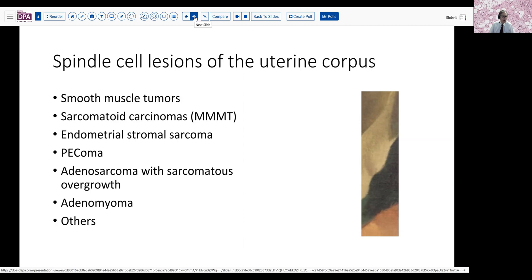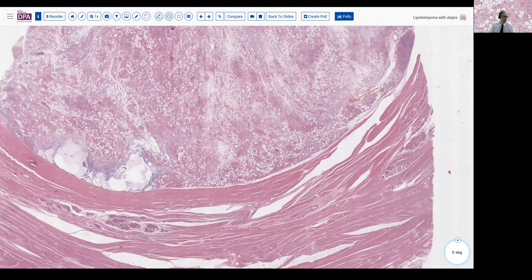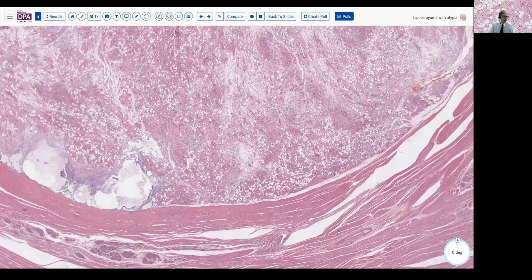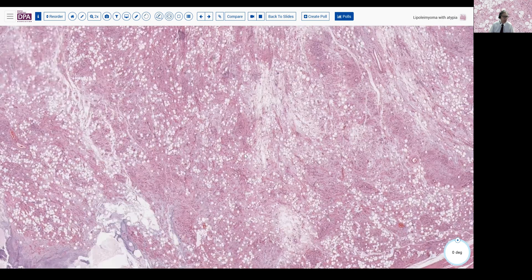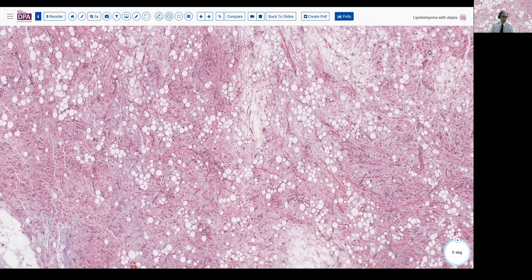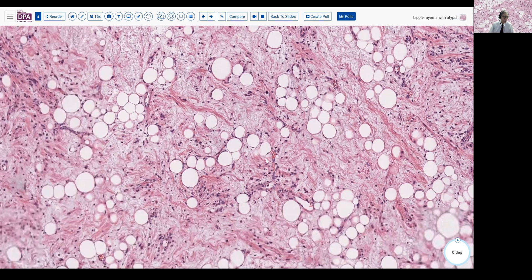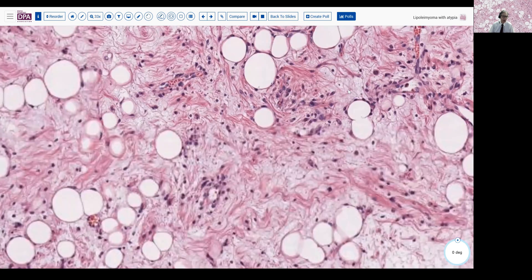So this sort of raises an interesting differential. Looking a little further at this case, we looked very carefully at the margins, which were quite sharply demarcated. There was no sense of any infiltration of this tumor into the surrounding myometrium. There was some myxoid mucoid degeneration, but still some degree of persistent atypia in variable areas. And in some areas, it's almost totally fat or myxoid tissue, as opposed to just very small traces of residual smooth muscle tissue.